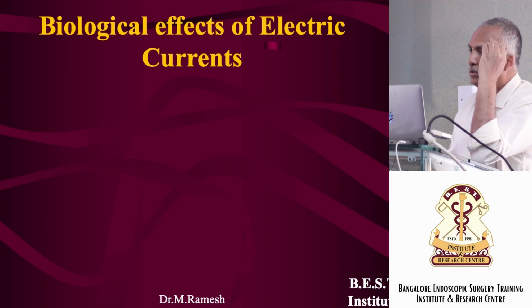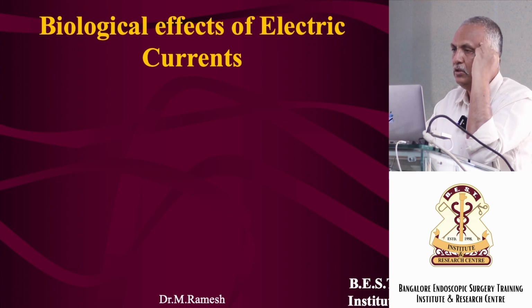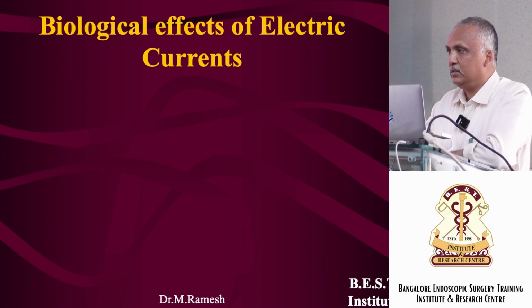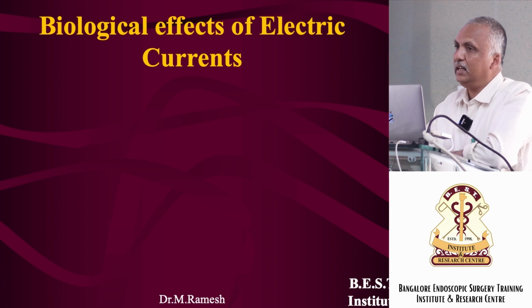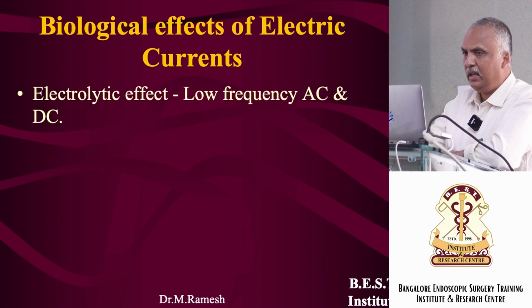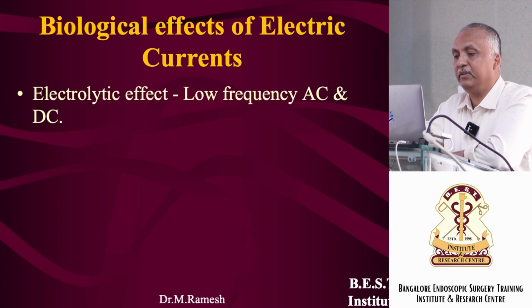Now, electrosurgery means you are applying electrical energy, and through using electrical energy you are doing an operation. So it is called electrosurgery. But then what does electricity do to a human being? We have something called an electrolytic effect.